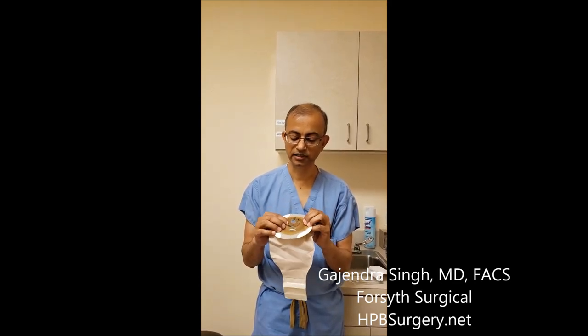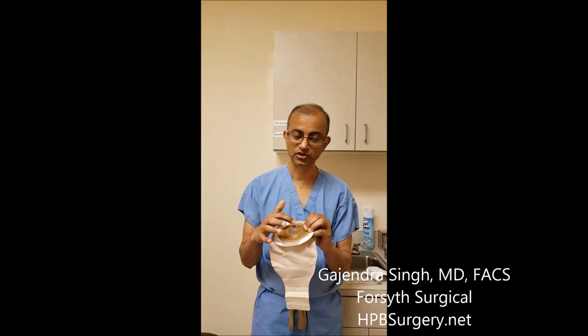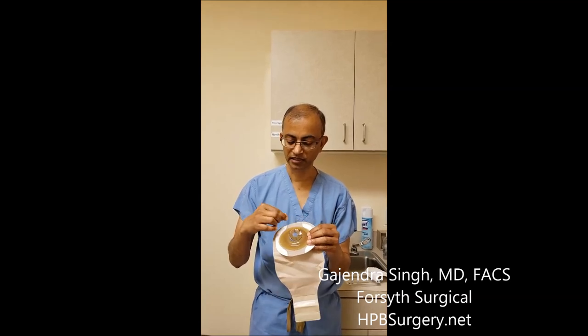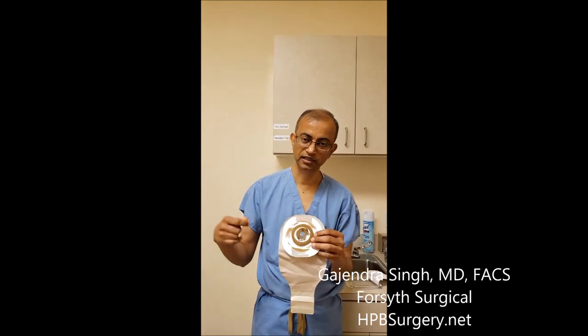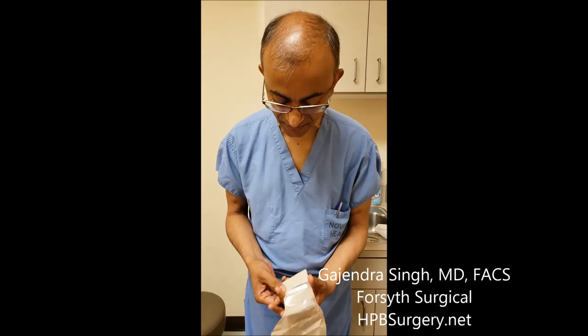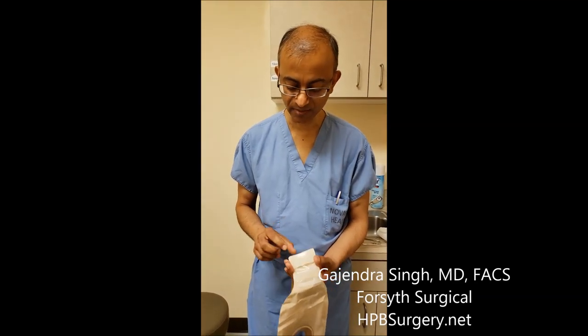I've started cutting this over here. The patient has a larger size loop colostomy, so we're going to cut a bigger circle and make a hole in there. We'll take this off, clean out the area, and put the bag on. What we've done here is made a circle opening.